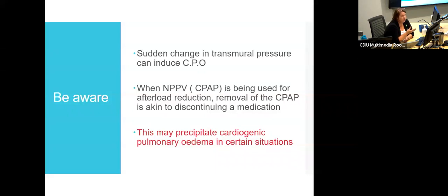When you remove non-invasive ventilation, if the indication for using that is respiratory failure, we've talked a lot about how to assess respiratory conditions and respiratory work of breathing. So if I remove that mask and I look at my patient and their work of breathing increases almost immediately, I can very clearly see that they are still requiring their non-invasive ventilation.